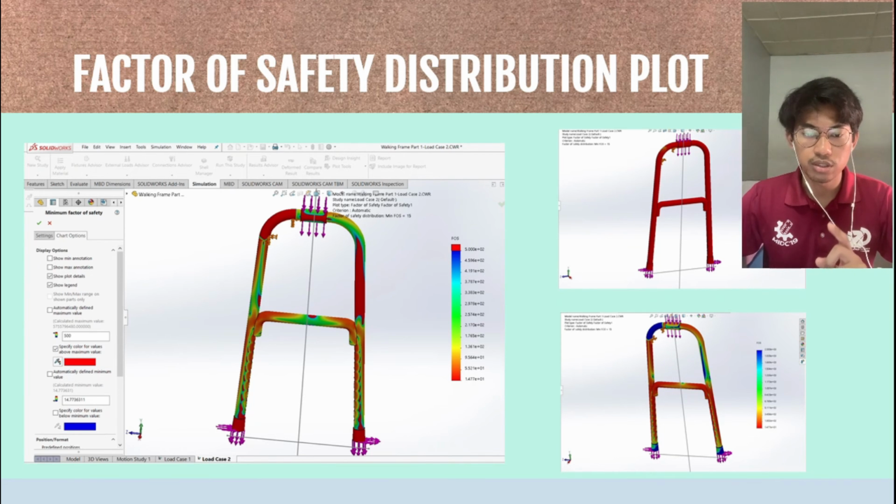The difference in color is due to the size of the mesh that is being used. For the high quality mesh, the size is much smaller compared to the draft quality mesh. So that's why it gives an accurate and precise reading.